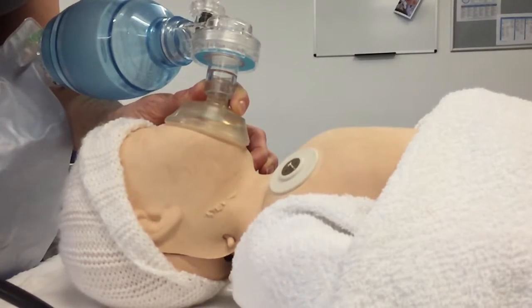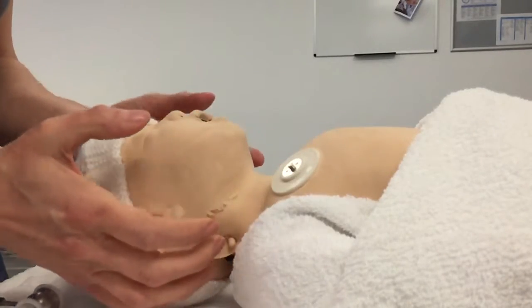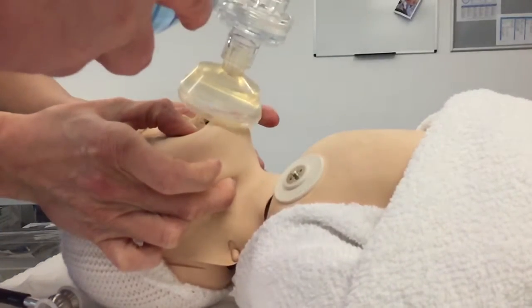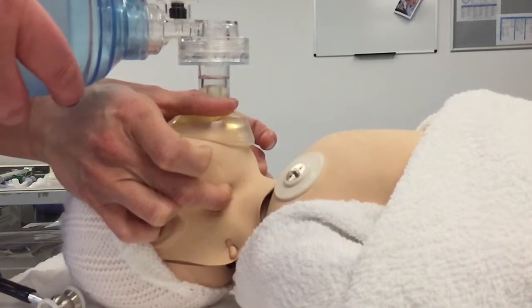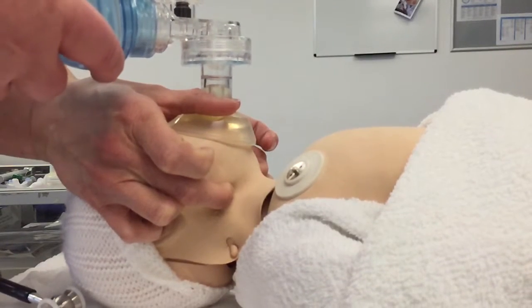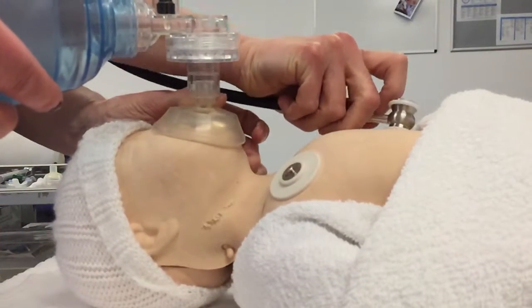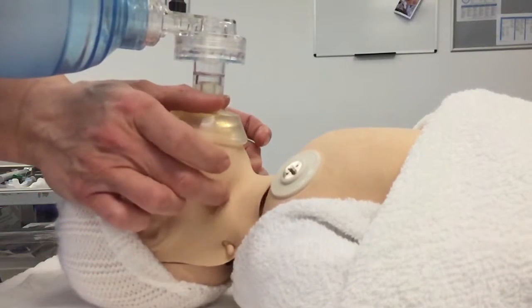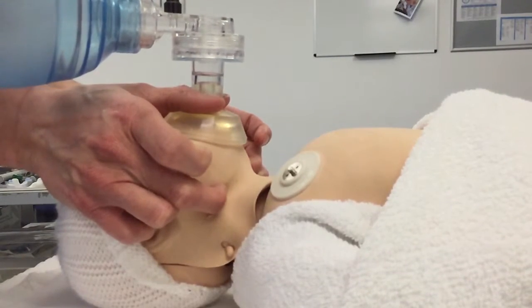If my help has arrived, I'll consider a two-person jaw thrust. I'll give you the bag — I'm going to use exactly the same technique: two thumbs on the baby's cheekbones, bring the jaw forward, and I'd like you to roll the mask over the top for me. I'll hold and secure that in place with my two thumbs, and I'd like you to give five long, slow, sustained inflation breaths. Then I need to reassess the baby. Heart rate is still slow, no respiratory effort, no chest rise — still pale and floppy.